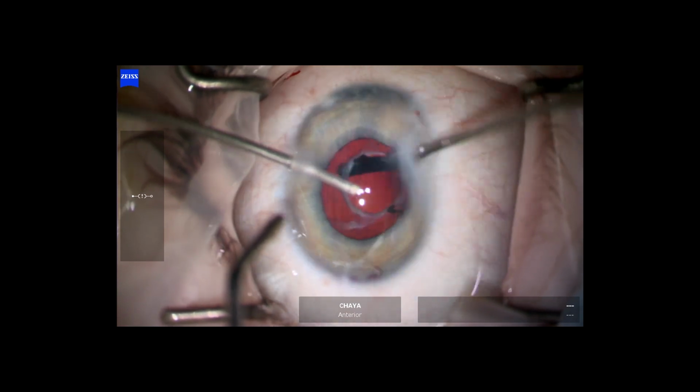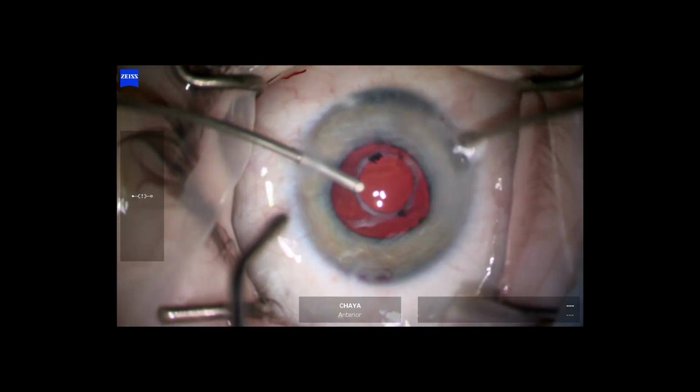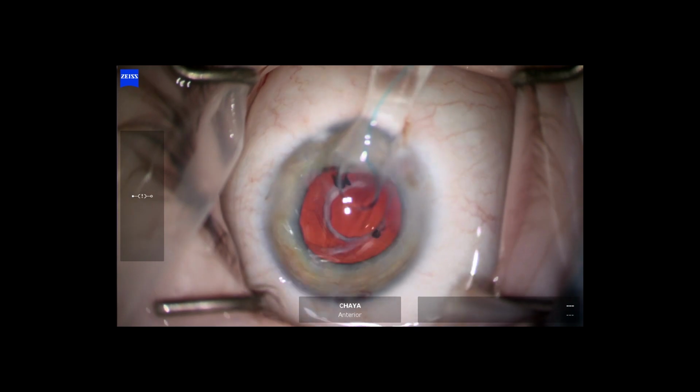Overall, your goal should be a clean capsule with a stable and centered lens that will produce a good visual outcome for years to come.